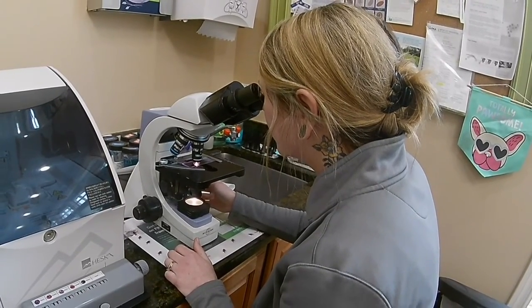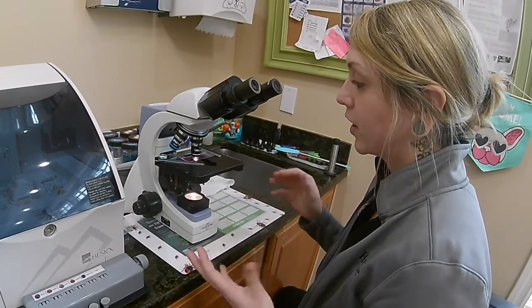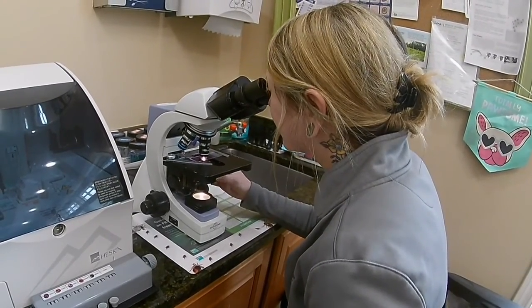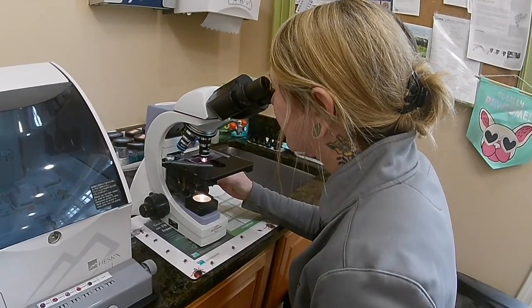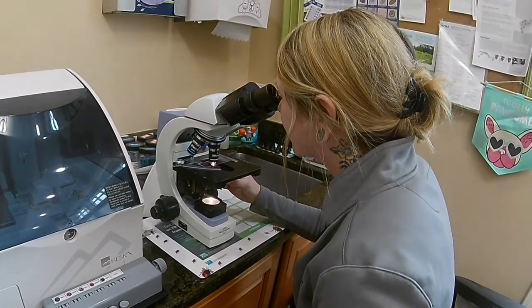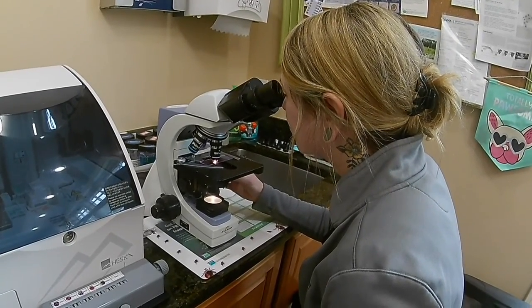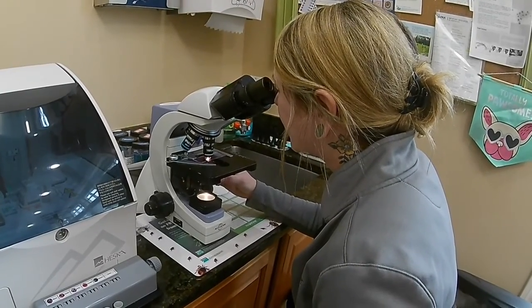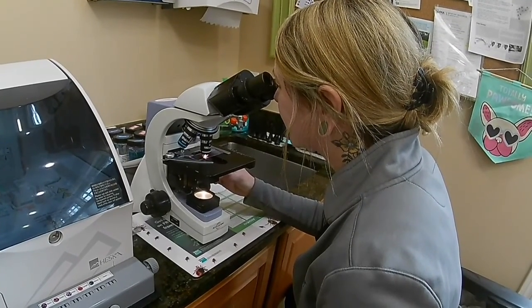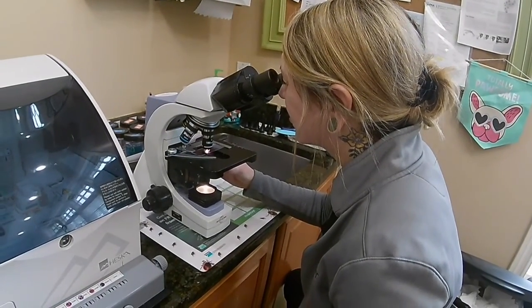There we are. So I'm looking for fields where the cells aren't too stacked on top of each other, and they also aren't too spaced apart, and that is that monolayer I was talking about, and that is the ideal area to be. So let's get into that. I'm also going to be refocusing as I'm switching fields, as things can go out of focus as you're moving around. Okay. So I think I'm at a good place right here.